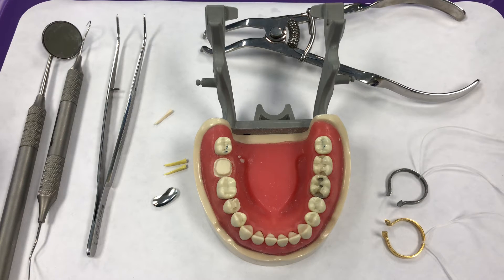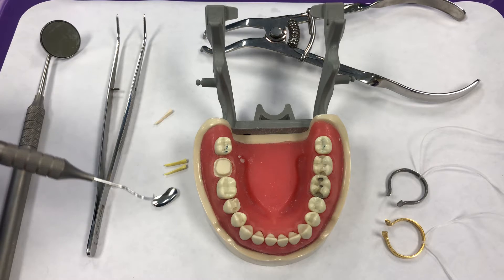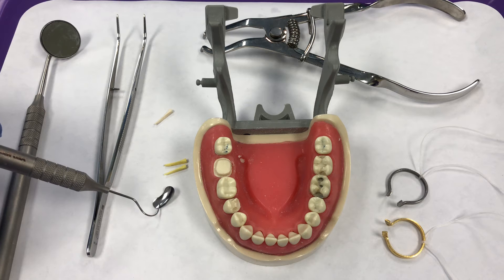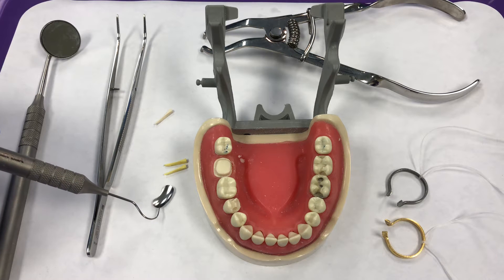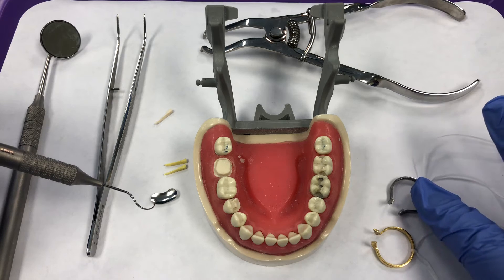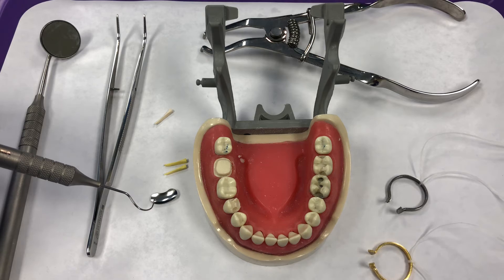We are going to work on tooth number 19 today. Tooth 19 has an MO preparation. To use a sectional matrix system for this, I only need one matrix because we're only dealing with one proximal surface, and I just need one of these rings. It really doesn't matter which one I use as long as I place it on the tooth properly.